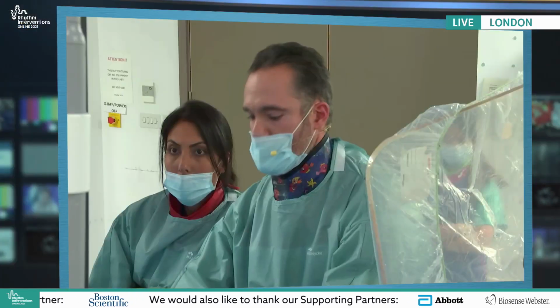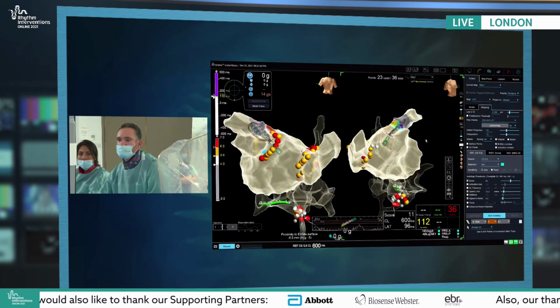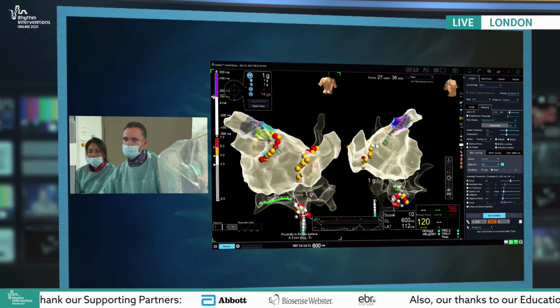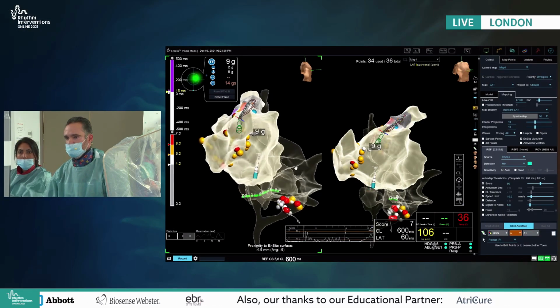So do you want to F7 that? I would say that all looks very far field. Do you want to show me an RA on the right? If I can pick back across easily to pace the appendage, I will, but maybe I won't fight for it. So maybe we can see the signals as well. I agree with Jan that we don't give adenosine or isoprel at the end.